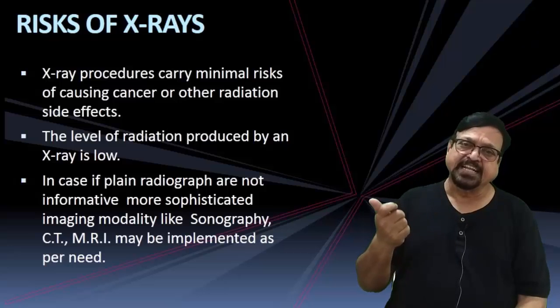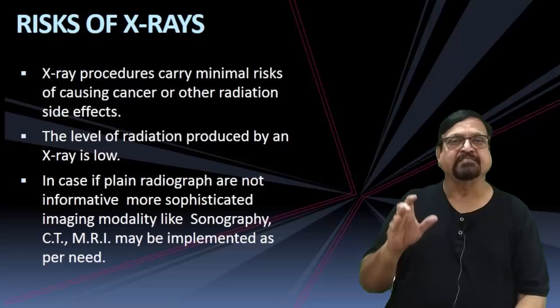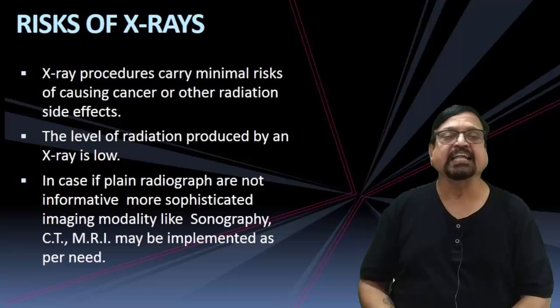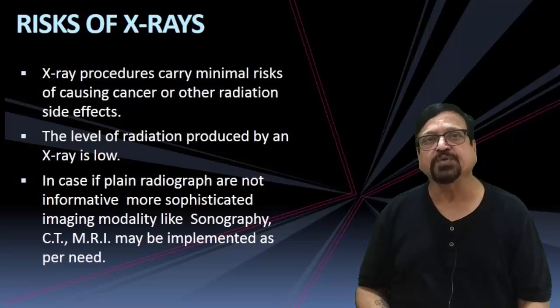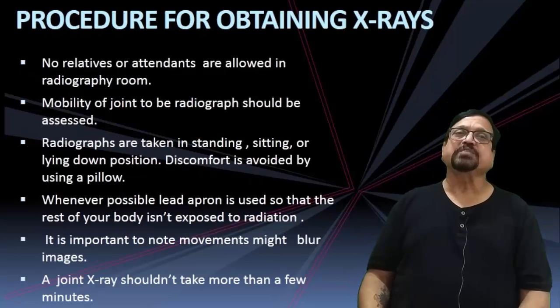While going into the details of this lecture, we are going to see all these things and where to apply CT, where to apply MRI, and where to apply sonography. All things we are going to discuss in detail once we go ahead in the lecture. Now, what is the procedure for obtaining X-ray?